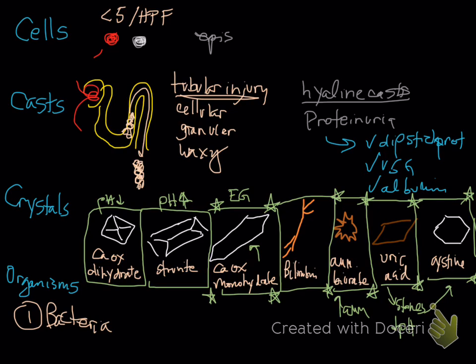And then there's other systemic diseases where we can actually see infectious agents in the urine. They're less common, especially fungal disease. The last thing to mention, although clinically insignificant, are things like lipid, mucus, and of course spermatozoa. We're going to practice recognizing all of these things in the UA lab in a few weeks.